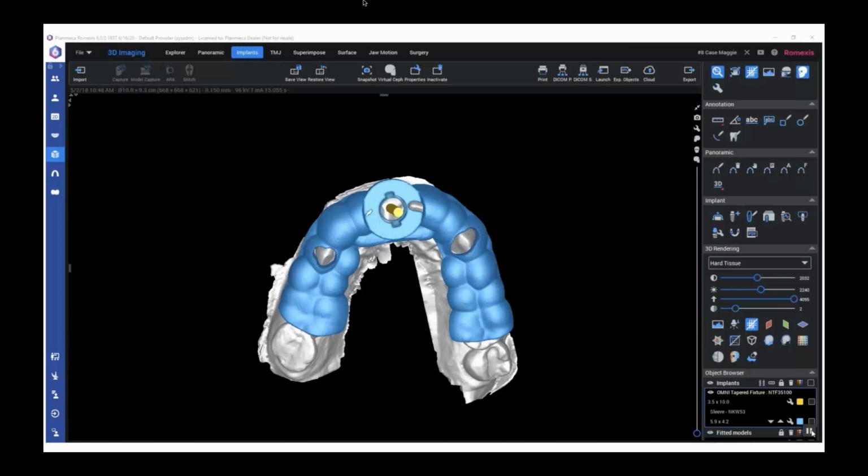I think I work with the world's best digital dentist, and his name's Wally. But if I can do it, anyone can really do it. I spend, on average, a total of about 15 minutes planning an implant case. If I think about that from a time cost perspective, if I send a case out for a surgical guide, I'm paying enough that I feel like it justifies my time to plan these cases, to do the wax up and to plan the case and print my own guide.